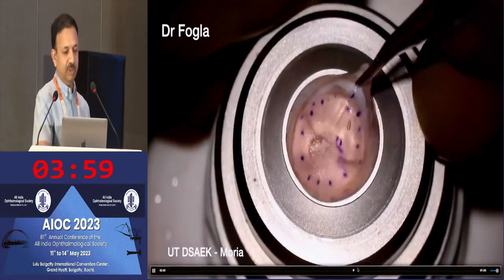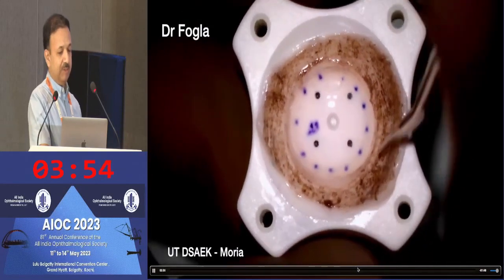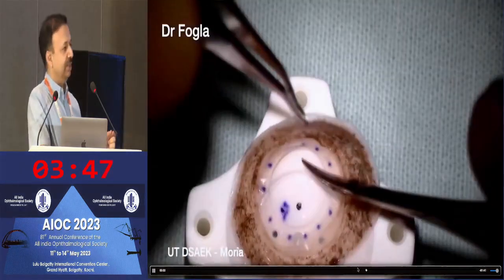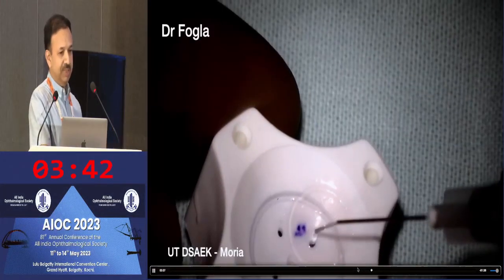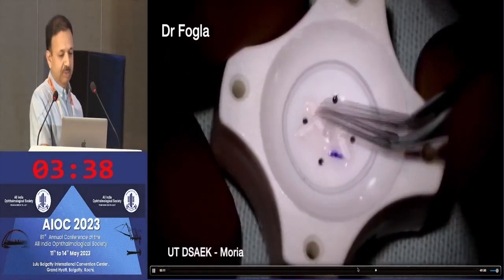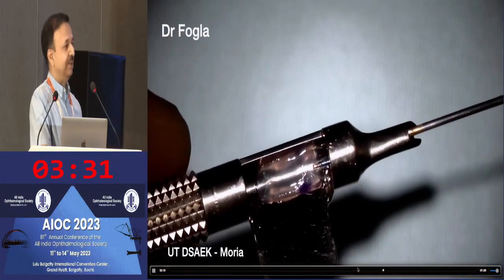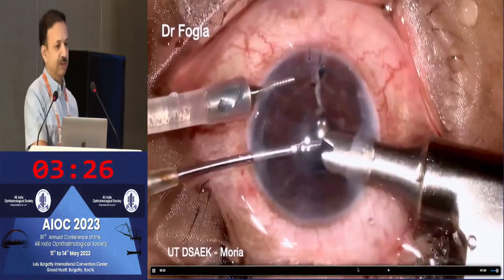We take the donor tissue from the artificial chamber. We have peripheral marks that help with centration. We also apply an F stamp for orientation identification, because unlike a regular DSAEK graft, an ultrathin DSAEK graft is very flimsy — it can flip very easily. Before loading onto the injector, we put a little viscoelastic and do a tri-fold. If you try to pull it like a regular DSAEK graft without the tri-fold, it can flip, turn, or curl the other way.